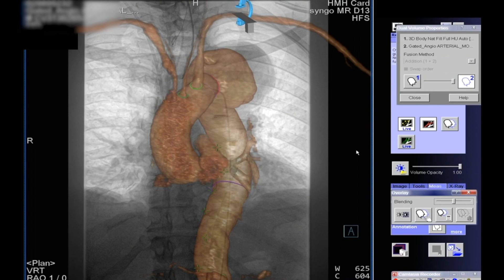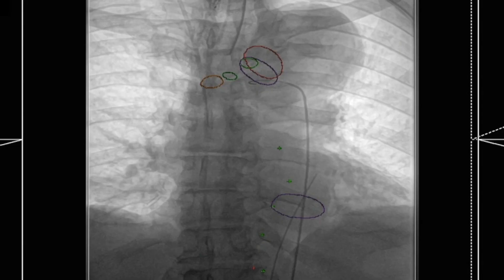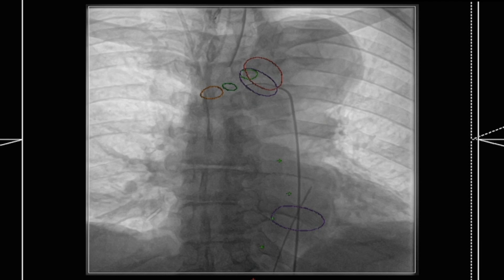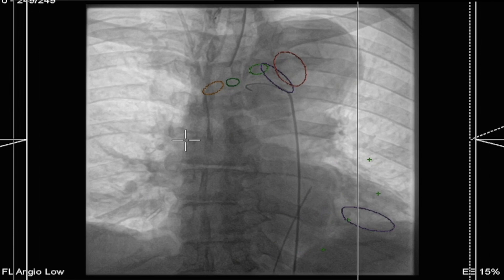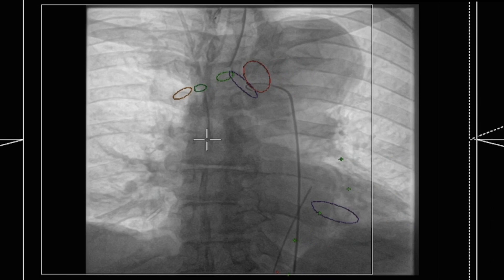Here we've actually overlaid the entire 3D construct. However, often this obscures the underlying devices. And so in this situation, you can see the marks represent the neck, the subclavian and carotid and the innominate takeoffs. You can see the gantry has been moved into left anterior oblique position, opening up the aortic arch. And at this point, we haven't given the patient any dye.